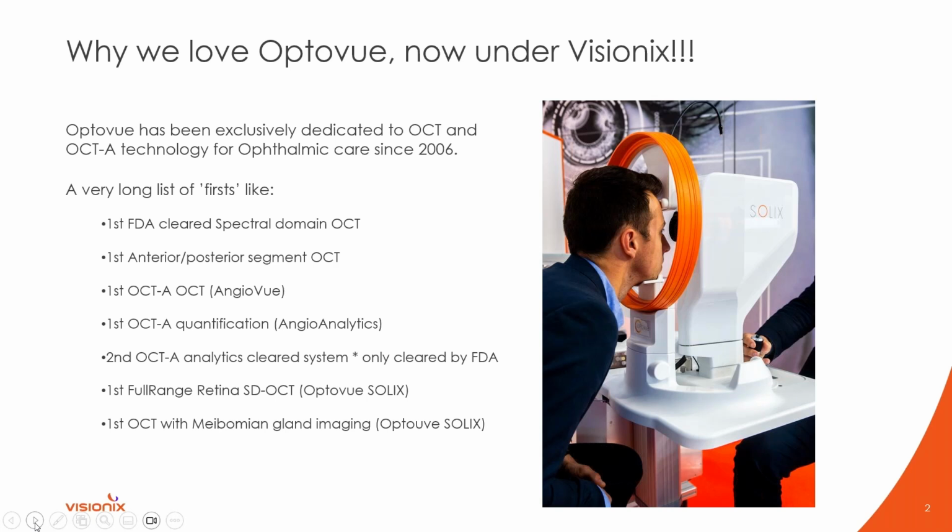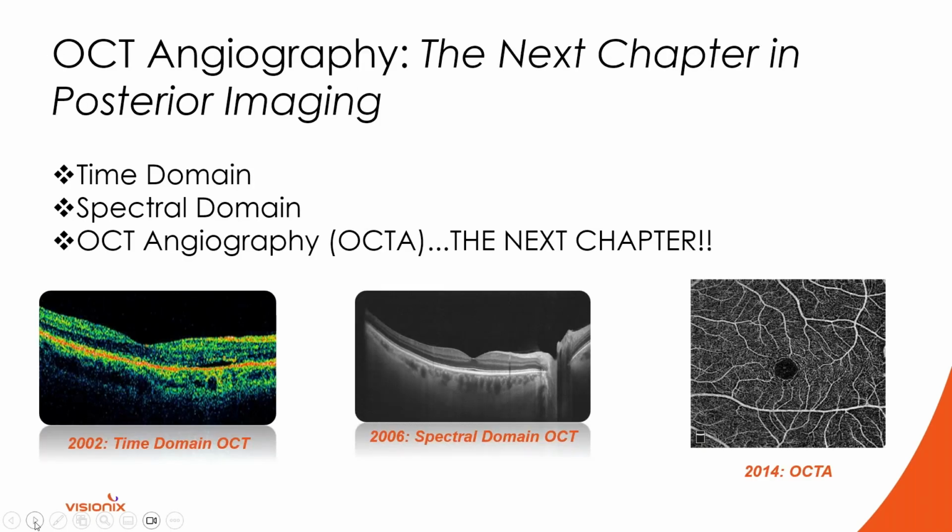This company also has full range retinal features, which allow for taller and wider scans, meibomian gland imaging, and what I didn't add on here is brand new topography. So this really is a multimodal imaging modality, not just an OCT machine.